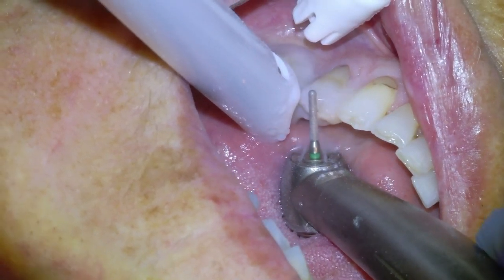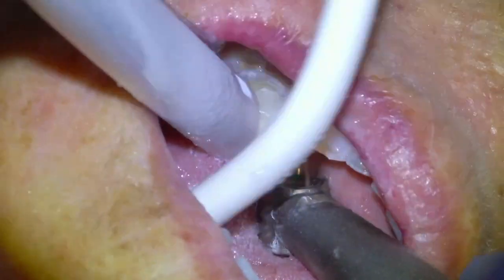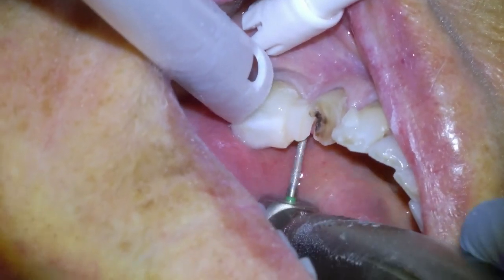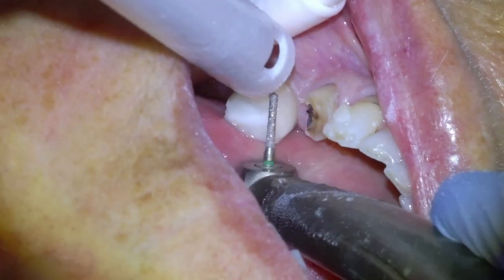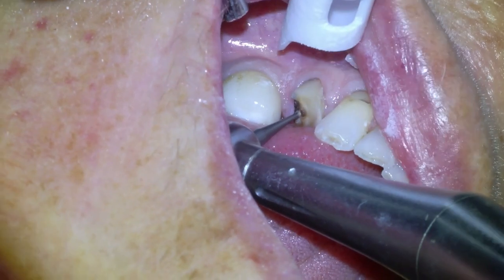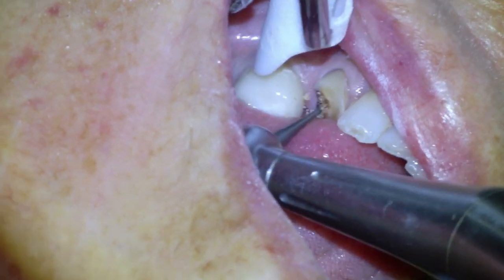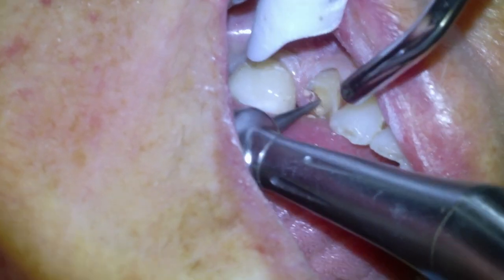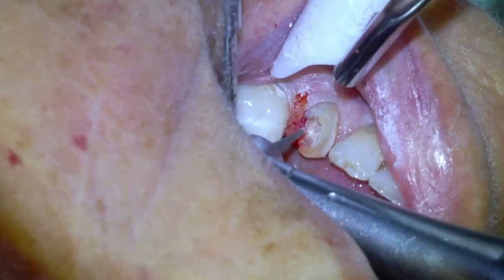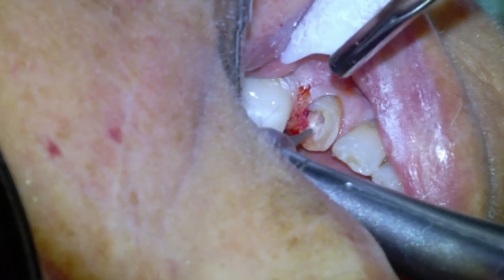Anytime I'm doing a crown and endo at the same appointment, I'll usually do the occlusal reduction first just to get us that much closer to the orifice of the root canal. Then we'll remove our tooth decay with a slow speed round carbide burr until we're pretty much into the pulp chamber. When we looked at the PA of this tooth, we could see it was a pretty wide open canal, so we knew we'd have a pretty simple endo.